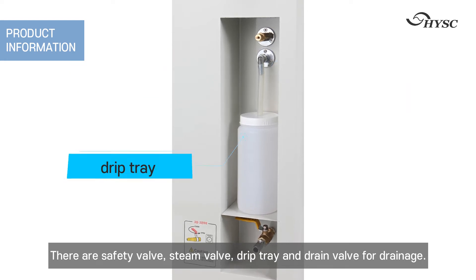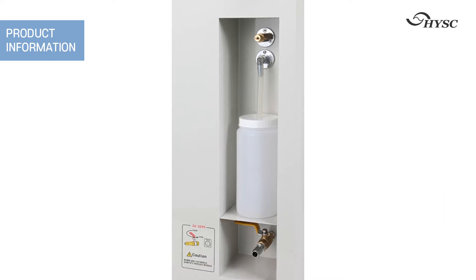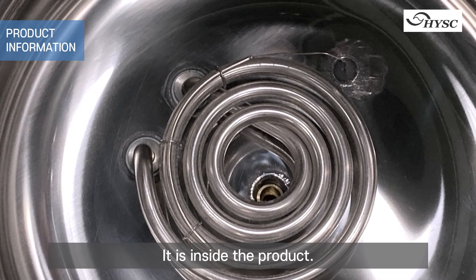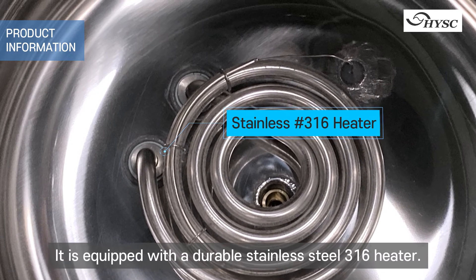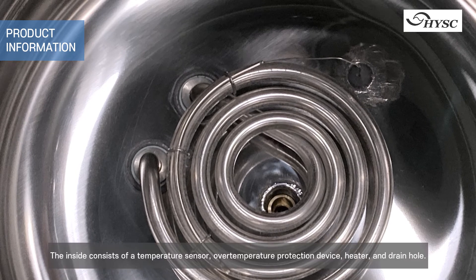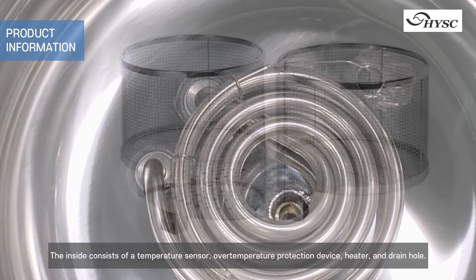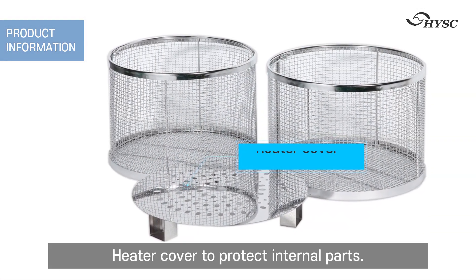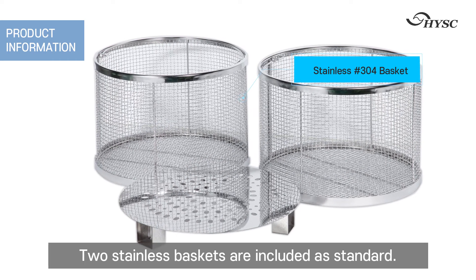Inside the product, it is equipped with a durable stainless steel 316 heater. The inside consists of a temperature sensor, over-temperature protection device, heater, drain hole, and a heater cover to protect internal parts. Two stainless baskets are included as standard.